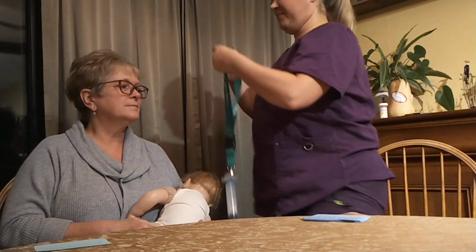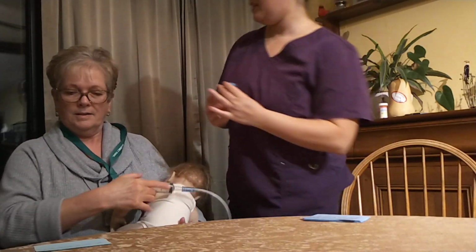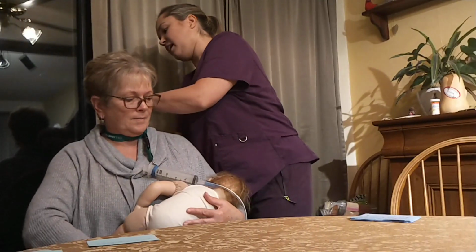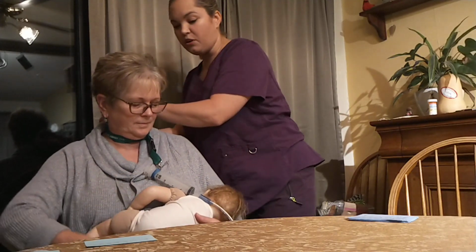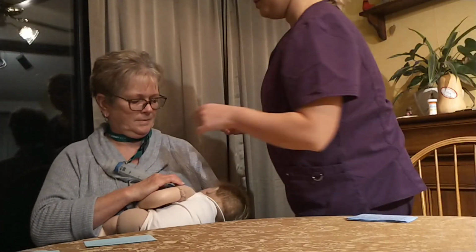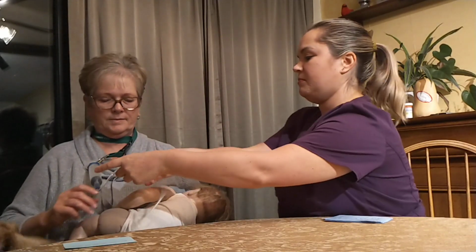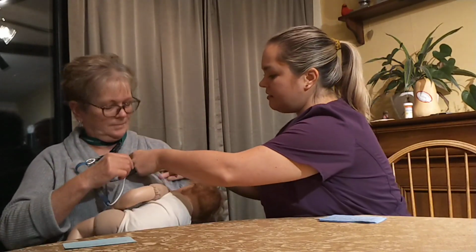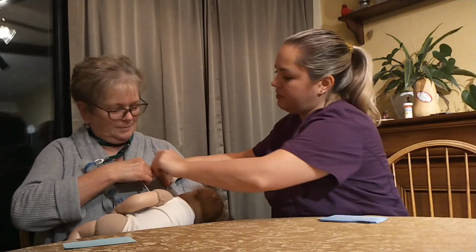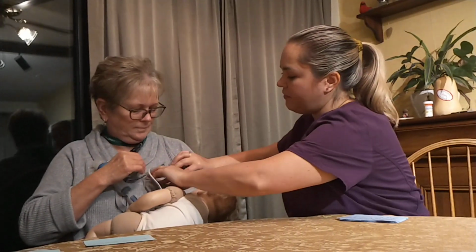Okay. May I touch you? Yes. Okay. So this just goes around your neck like a necklace. Okay. And I'm going to clip it just to bring it up a little bit higher. The higher it is, the faster the flow will be, so you can always adjust that. Okay. So now, your milk is going to go in this syringe here. And then, this tube is going to extend about 1 centimeter over your nipple. And you can tape it in place just to make it easier for you, so you have a hand free.